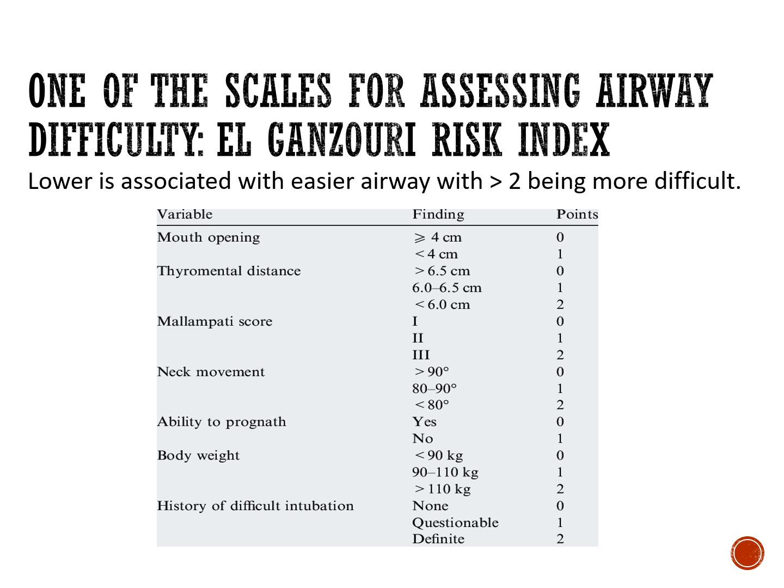And in the most extreme cases, there may actually be a trach cut-down kit to do an emergency tracheostomy in the most difficult circumstances, such as those involving situations where the airways may have been traumatized, a motor vehicle accident, industrial accident, extreme burns and fire, things along those lines.